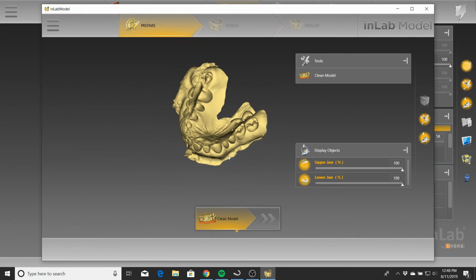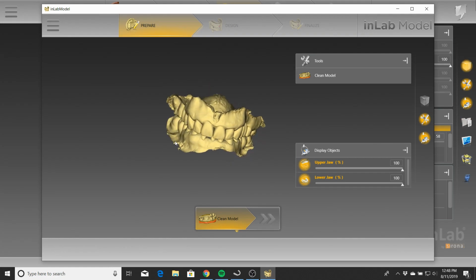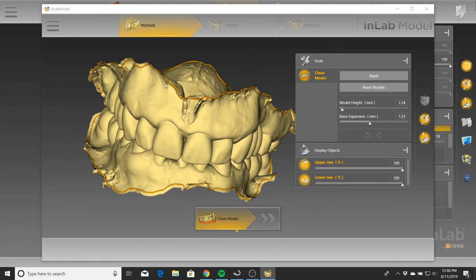And again, it can be time consuming, but if you really want to be in control of that and do your wax ups yourself, you will need to get the InLab software. But once you're here in this app, just clean up the model, go over to finalize, and you're ready to print. Hope this was helpful.